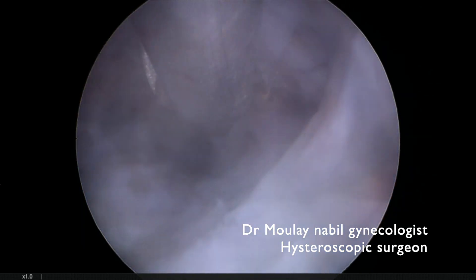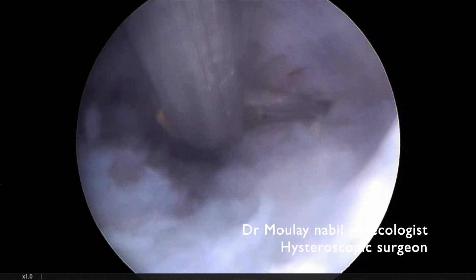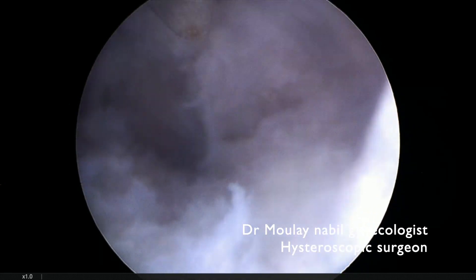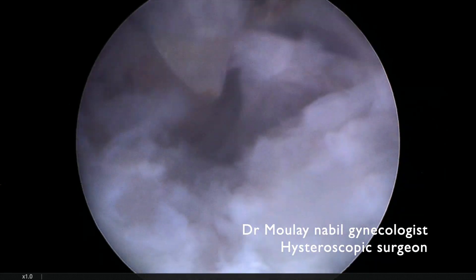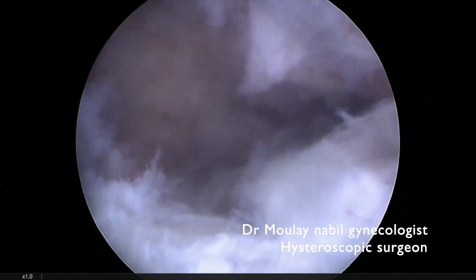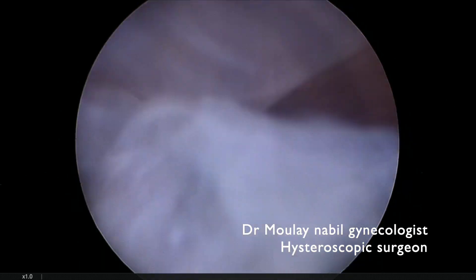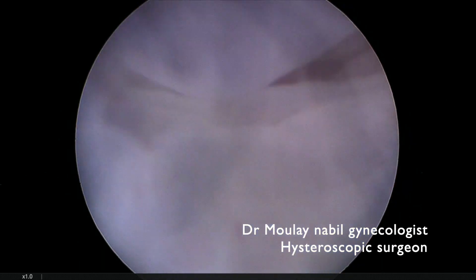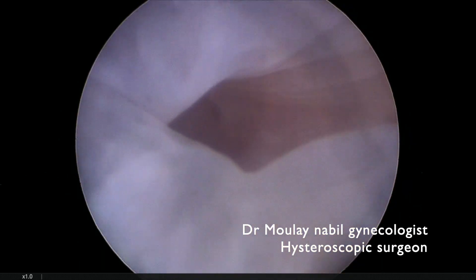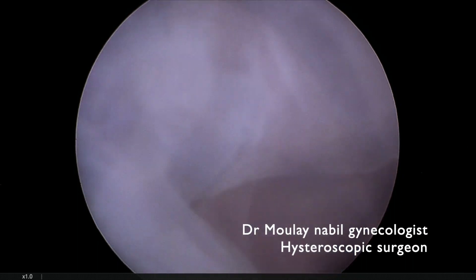As you see, after some section, we arrive at the left part of our uterine cavity with a good endometrium.